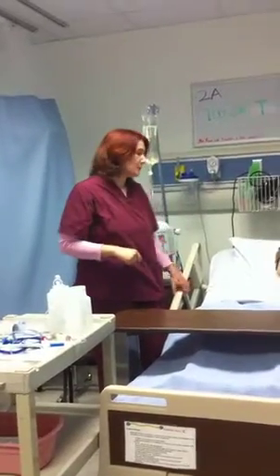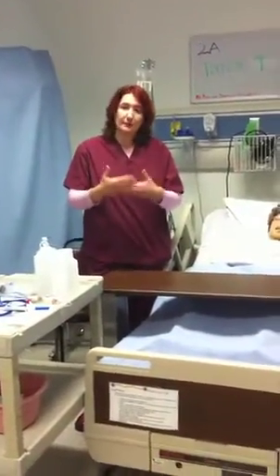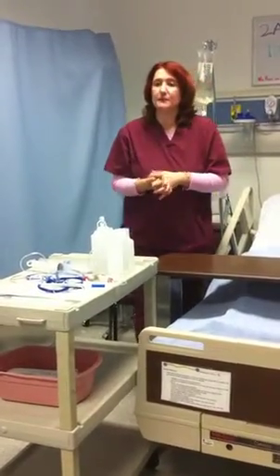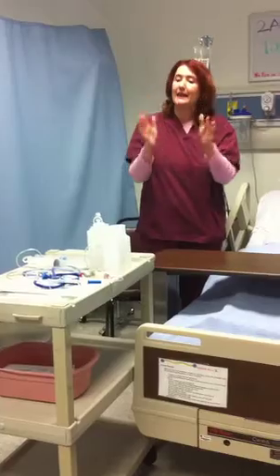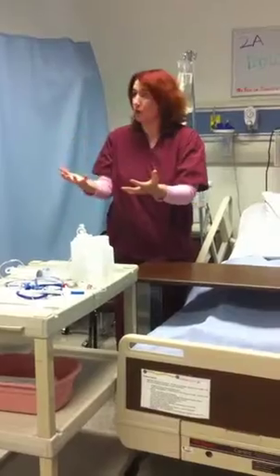It's painful. So in order to provide them with some relief, we insert nasogastric tubing, which at that time is usually connected to a suction system, and the doctor determines how often the suction needs to work. Is it intermittently? Is it continuously? And either way, what the suction force should be. That is all determined by the physician. But again, like I said, this information is for you, for future reference, so that you know some of the indications of NG tube insertion.